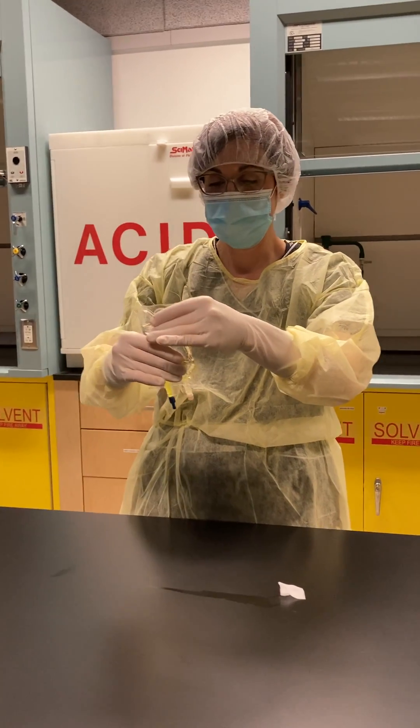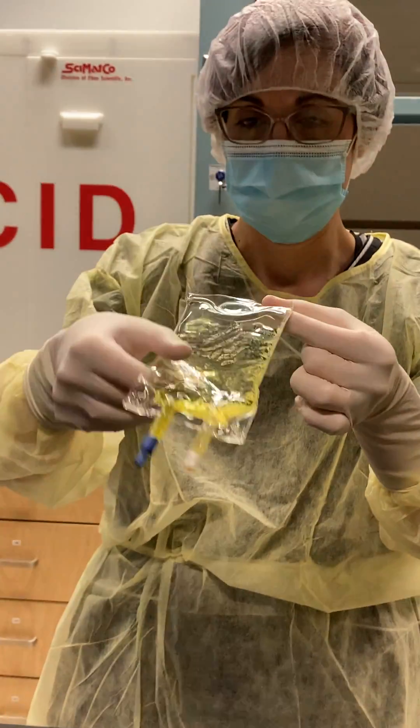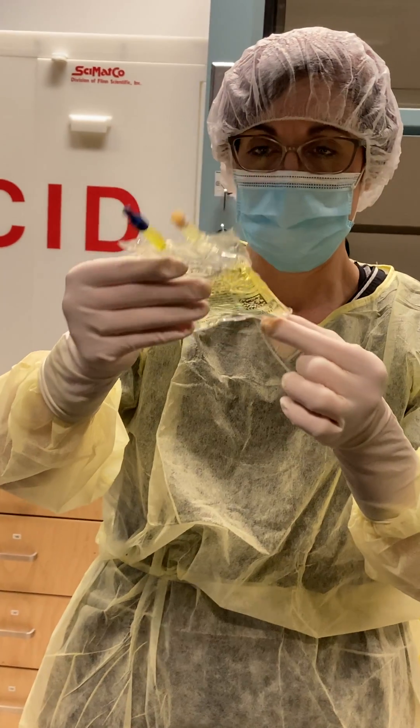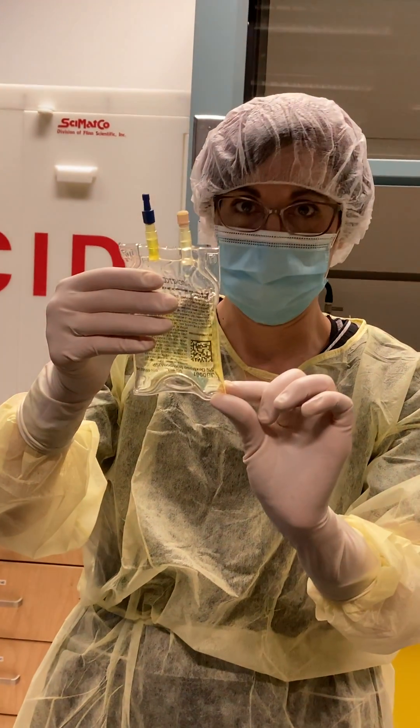And I'm going to check for leaks. Just gently mix the drug in my bag. I'm also at this stage looking to see if there's any particulate.